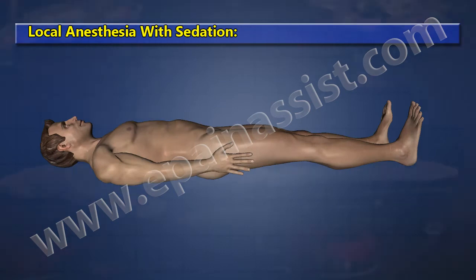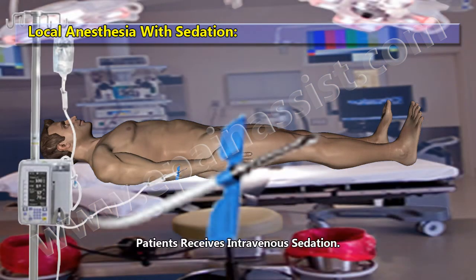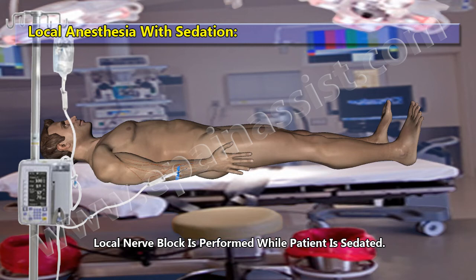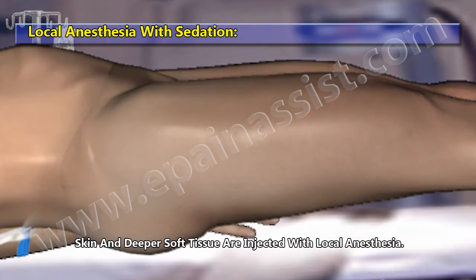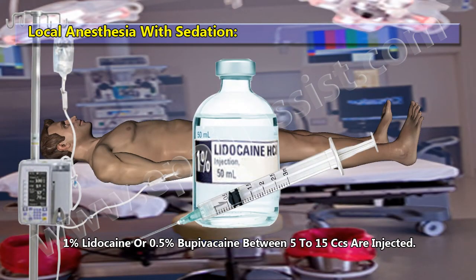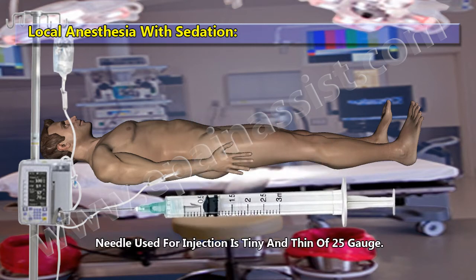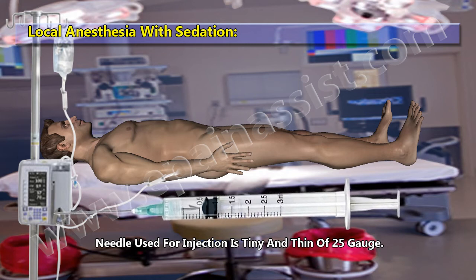Local Anesthesia with Sedation: the patient receives intravenous sedation. A local nerve block is performed while the patient is sedated. Skin and deeper soft tissue are injected with local anesthesia — 1% Lidocaine or 0.5% Bupivacaine, between 5 to 15 ccs. The needle used for injection is tiny and thin, of 25 gauge.